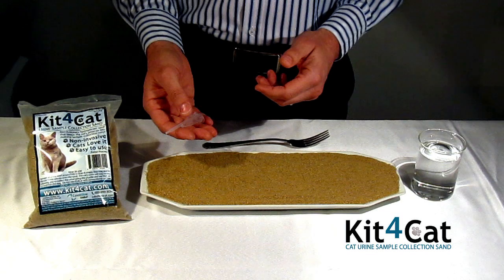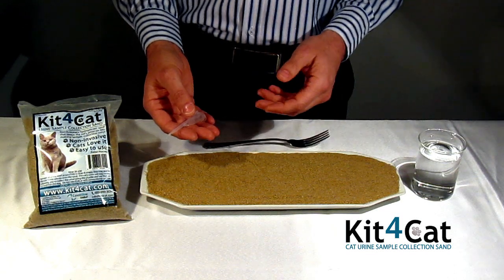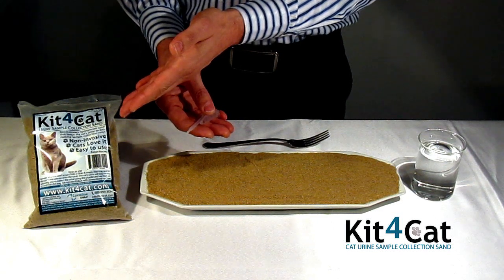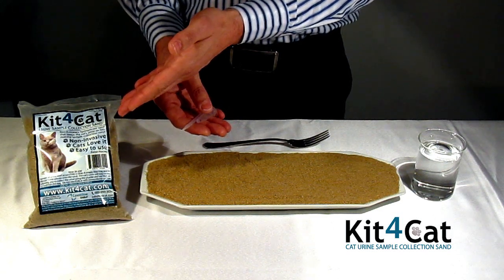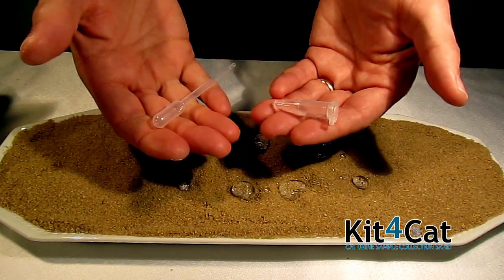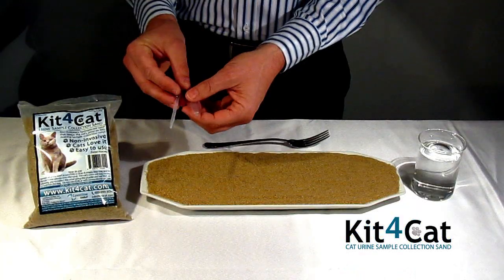Cats love the feeling, but when they urinate on top, everything stays beaded for easy collection. It is sold in two-pound bags, available from your local veterinarian and also from major US and Canadian distributors. Each two-pound bag also includes a pipette and a vial to allow for easy collection of the urine sample.